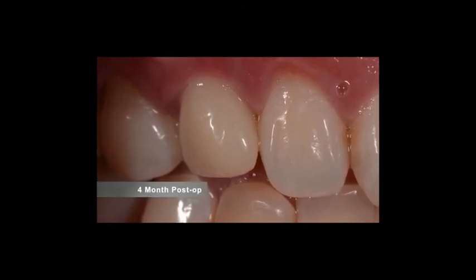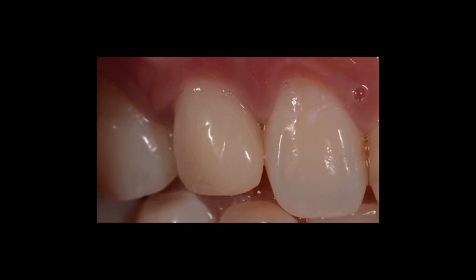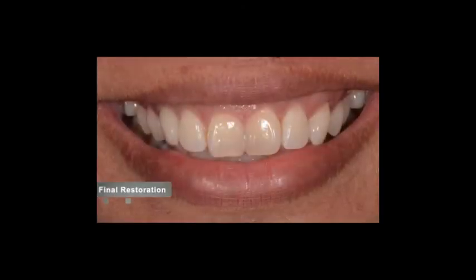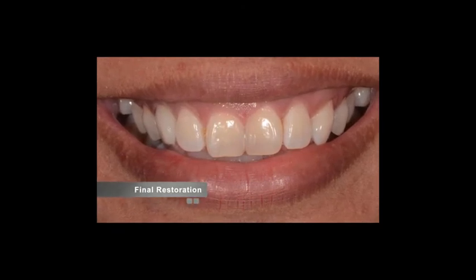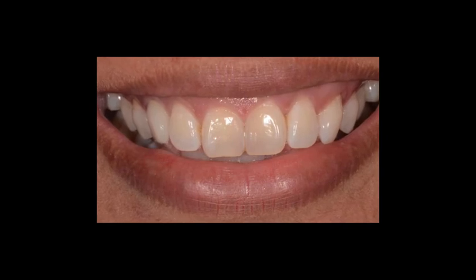And then this is a 4-month post-op. Typically we don't have to wait that long. I usually only wait 2 months. That's enough with these Straumann implants. And then after about 2 months, in this case it was 4 months, we take that temporary off. We can take another scan if we want, and then fabricate an Emax restoration.